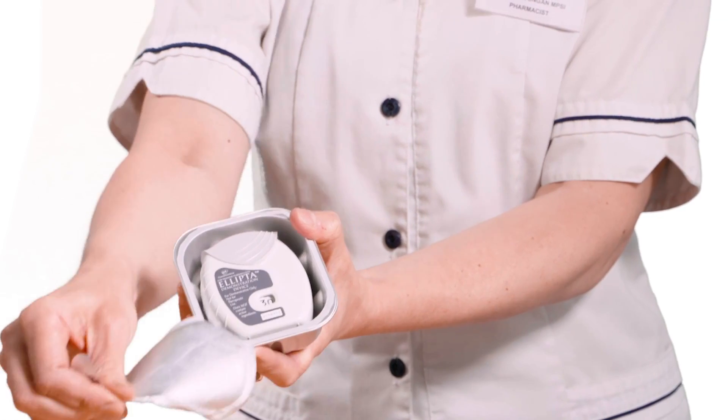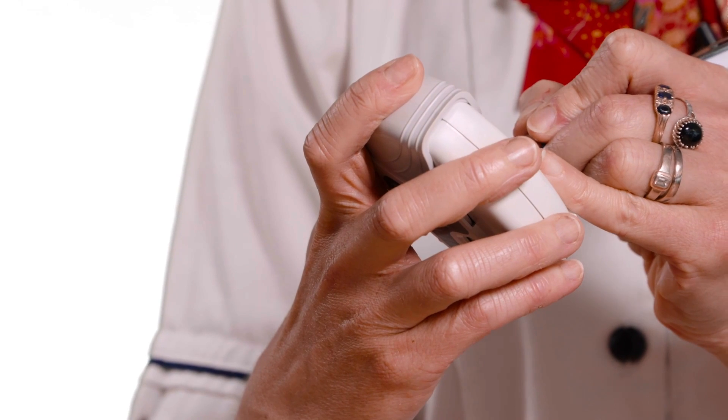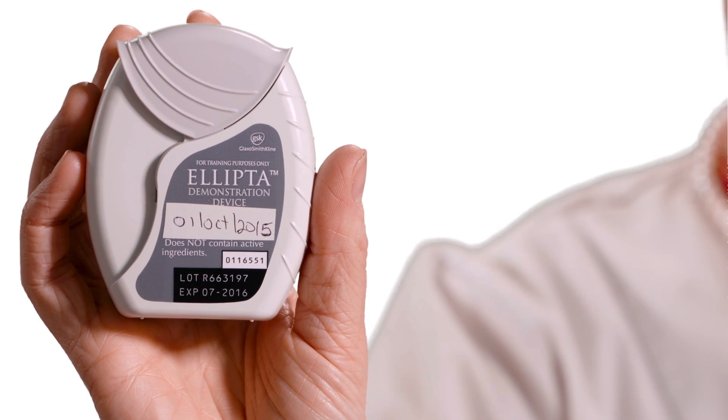When you first open the inhaler tray, write the discard date onto the inhaler in the space provided. This will be six weeks from the date when the tray was first opened.